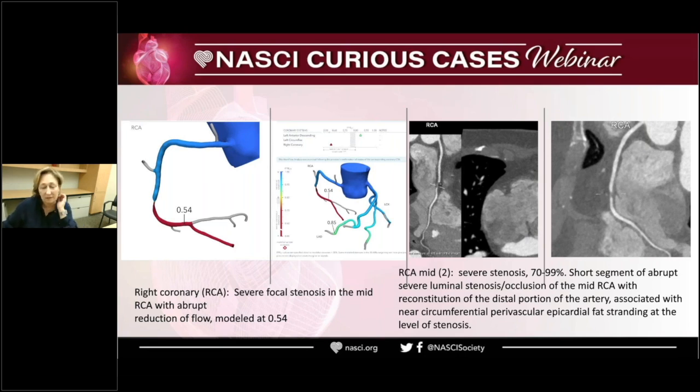Was that your question? Yes, it's tricky. Lipoprotein A can be elevated in patients and has been linked to non-calcified atheromatous plaques. So it can happen that you have non-calcified plaques with zero calcium. With SCAD, the only thing is I would expect it to be a little bit longer segment. That's the only hint, but I would call it the same thing: either stenosis or SCAD. Either stenosis from plaque, non-calcified plaque, or SCAD. Right. That was our differential as well.